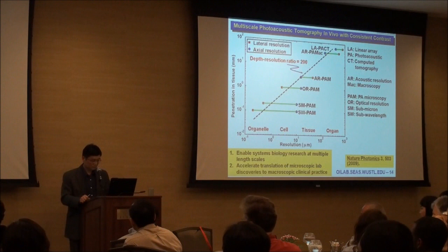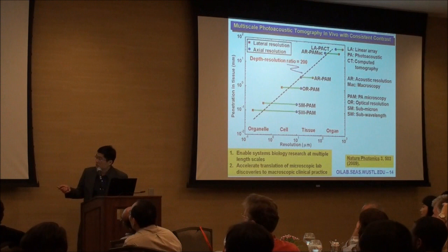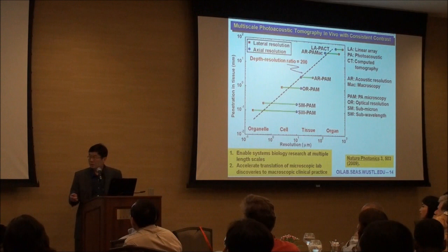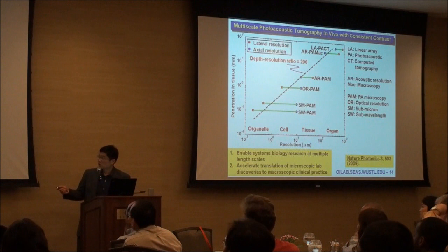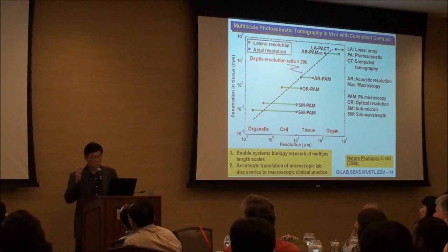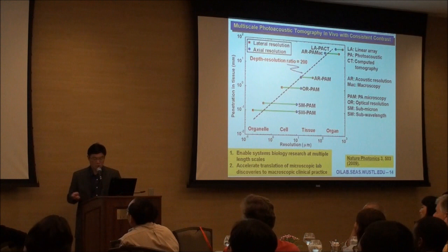Here I'm plotting the penetration capability versus resolution. You can see this is a scalable technique. Each bar represents a system implemented in our lab. For a given practical problem, you first identify how deep you need to penetrate. You come to the y-axis, identify the technology that's most suitable for your application, and then find out what kind of resolution we can provide. It's going to be scalable, so we're not going to provide one resolution at all depths. That would violate physics. I'll show you some examples later on.